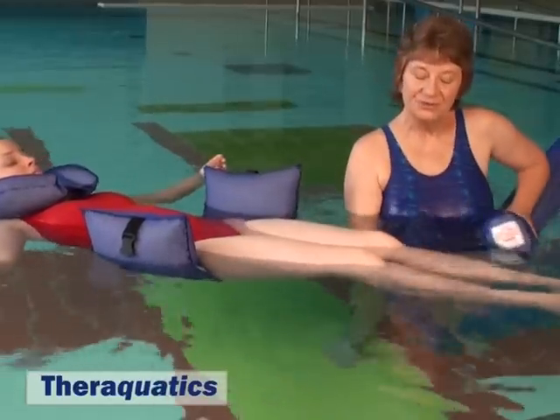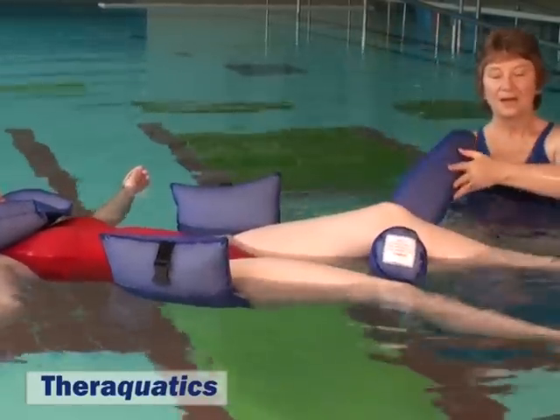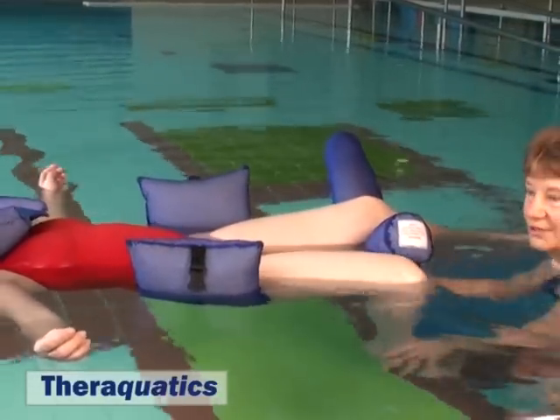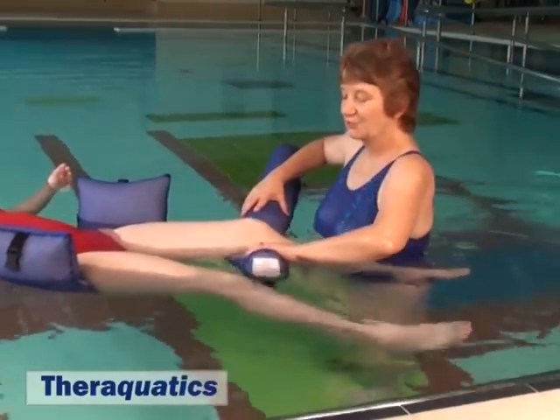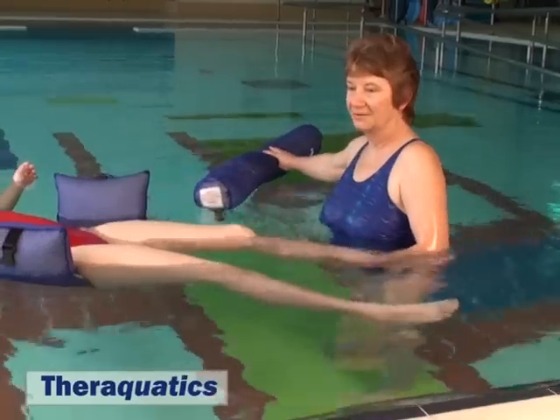It may also be used under one leg while the opposite leg is being worked or exercised. To remove the float, submerge one end and let it pop out beside.